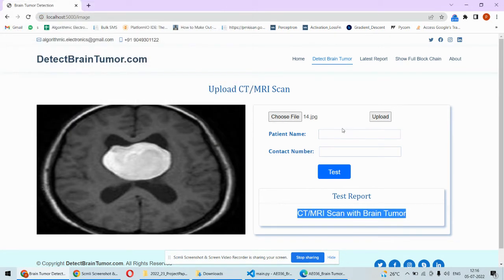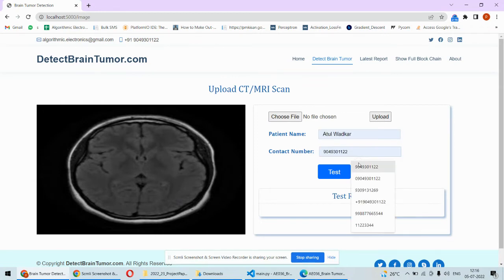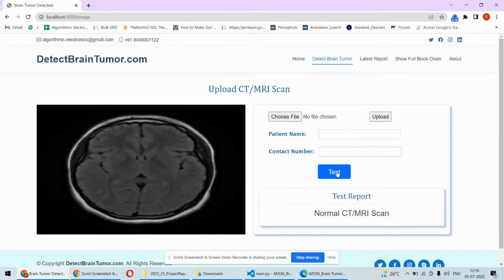For example this image, then you click on the upload, then that image will be uploaded over here and then you type the patient's name and all. So this is normal MRI or CT scan.